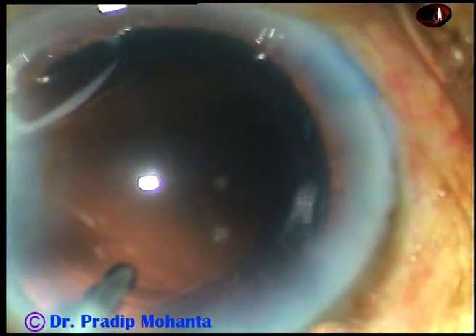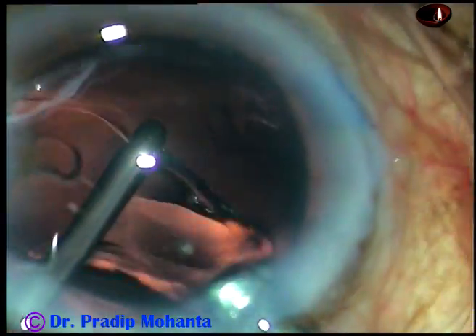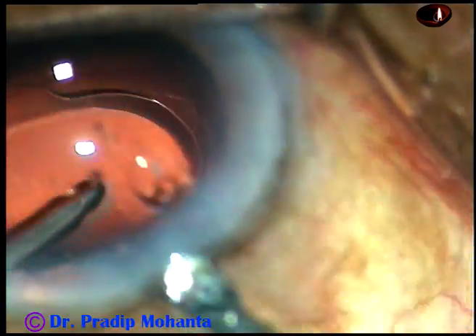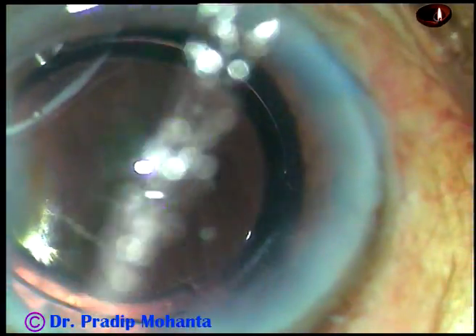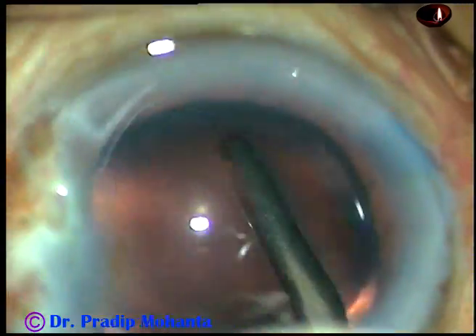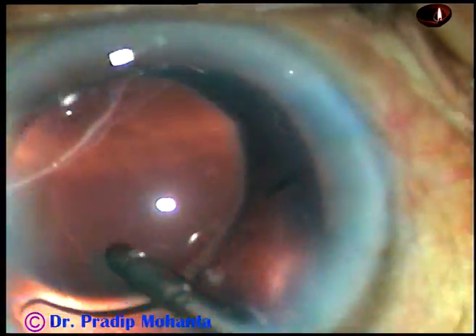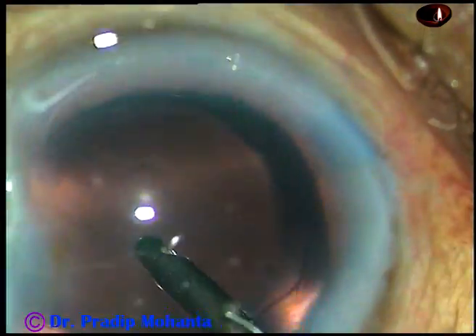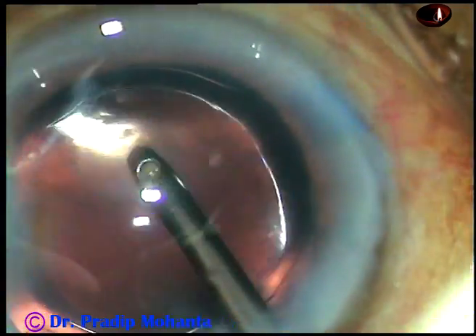And this is hydro-implantation of a foldable intraocular lens. The irrigating probe supports the optic of the intraocular lens so that the lens doesn't tumble or flip. It presses the junction of the optic and the trailing haptic, and the trailing haptic goes into the capsular bag.